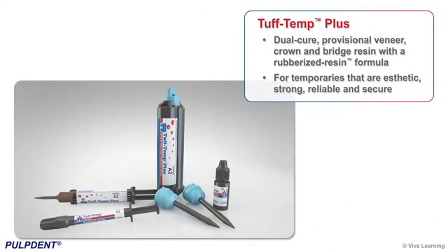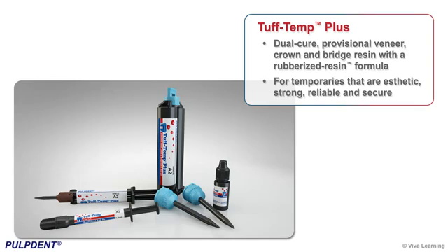To address these problems, Pulp Dent introduces new Tough Temp Plus, a dual-cure provisional veneer, crown, and bridge resin with a rubberized resin formula for temporaries that are aesthetic, strong, reliable, and secure.